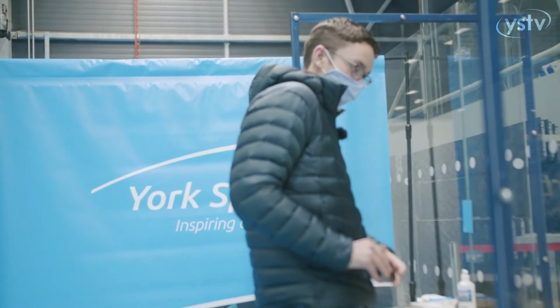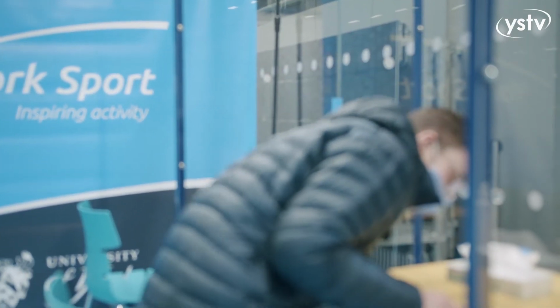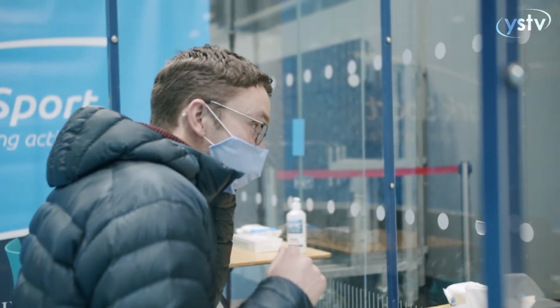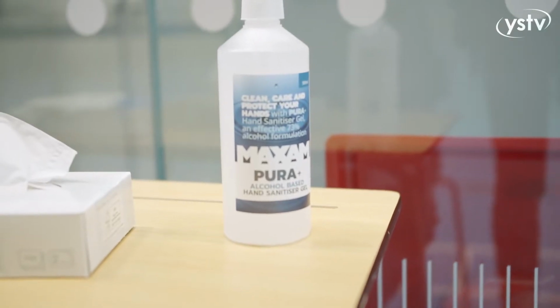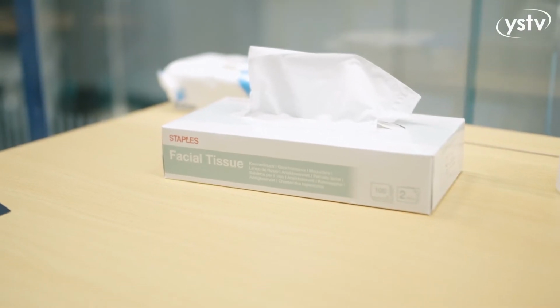So once you're here, you'll sit yourself down, and if you want to go ahead and try the seat out for size. When we're actually doing testing, what you'll be provided with is instructions for how to swab yourself, and a swab by the testing supervisor, and then a little test tube, which is where you'll leave your swab afterwards.